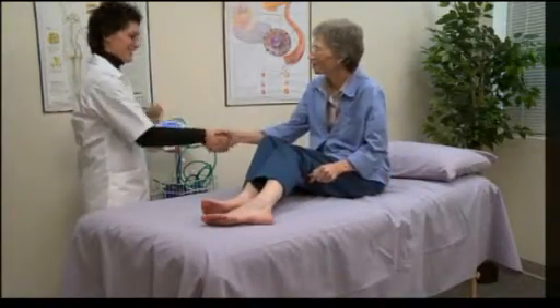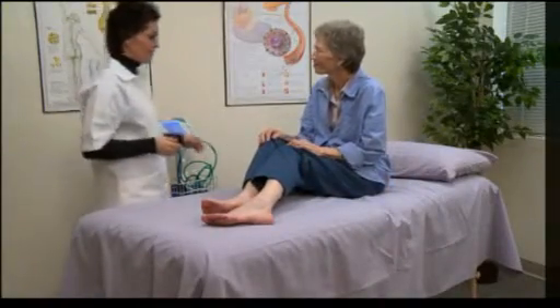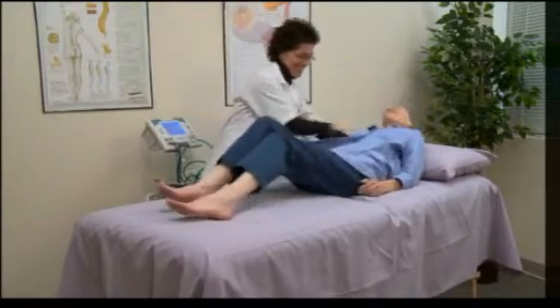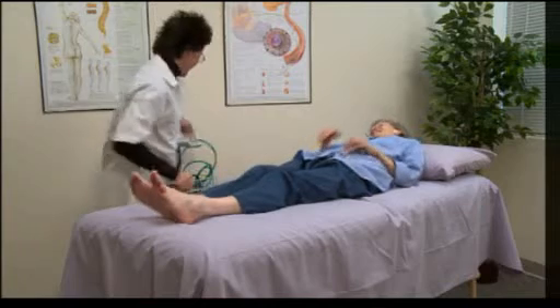Begin the exam by having the patient remove their shoes and socks. Allow the patient to rest in a supine position for about five minutes prior to taking pressure measurements.